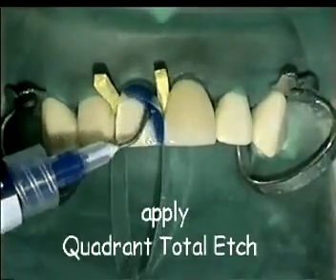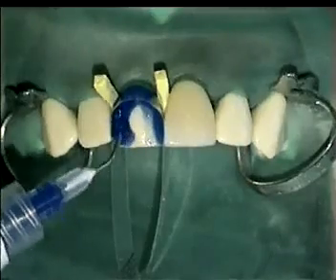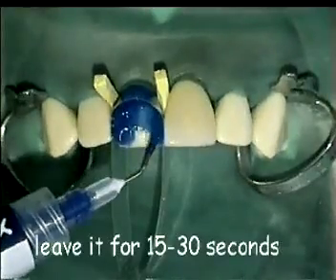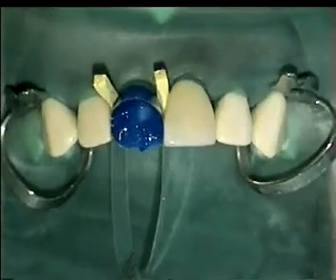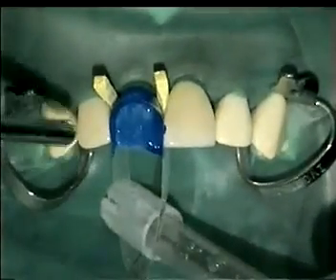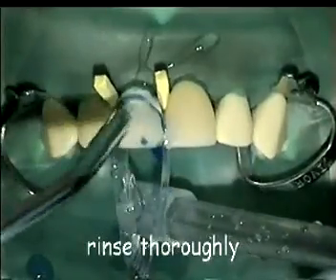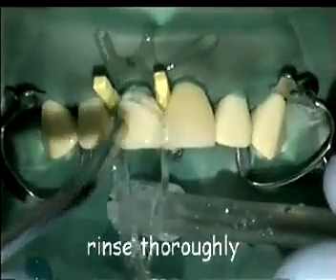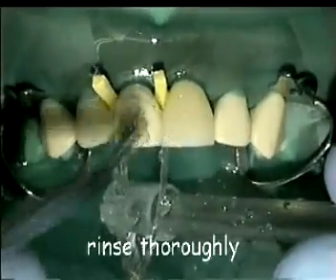Apply Quadrant Total Etch on the prepared surface. Leave it about 20 seconds in place. Rinse thoroughly and air dry until the surface has a frosted appearance.